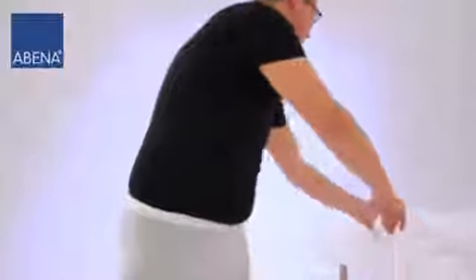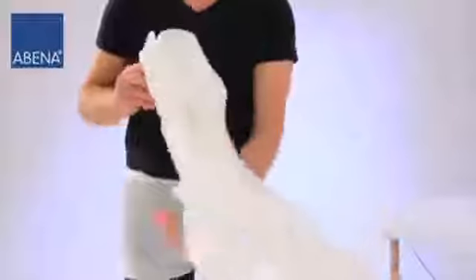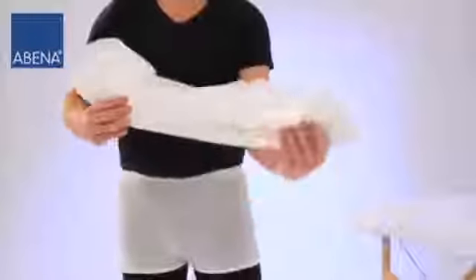Unfold the product without touching the inside. Bend the pad lengthways with the back sheet turned outwards and form it like a bowl.